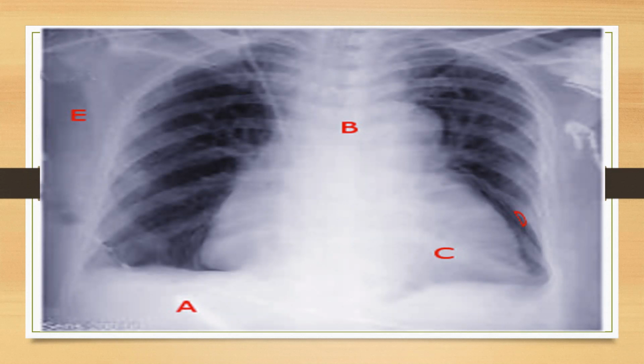This is the X-ray which is showing line placement in the internal jugular vein.